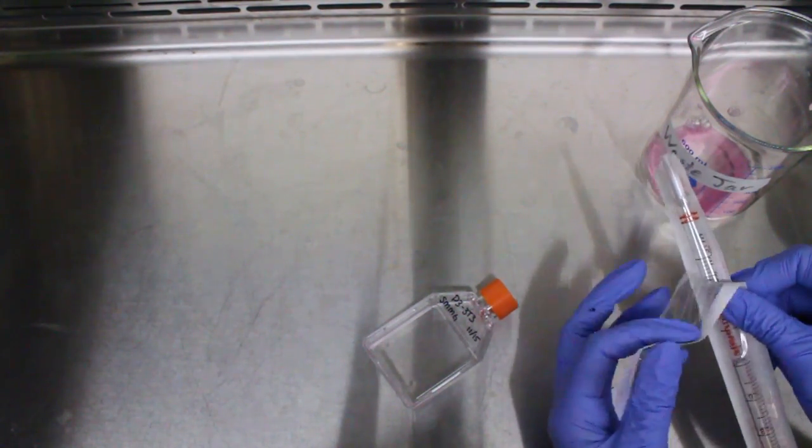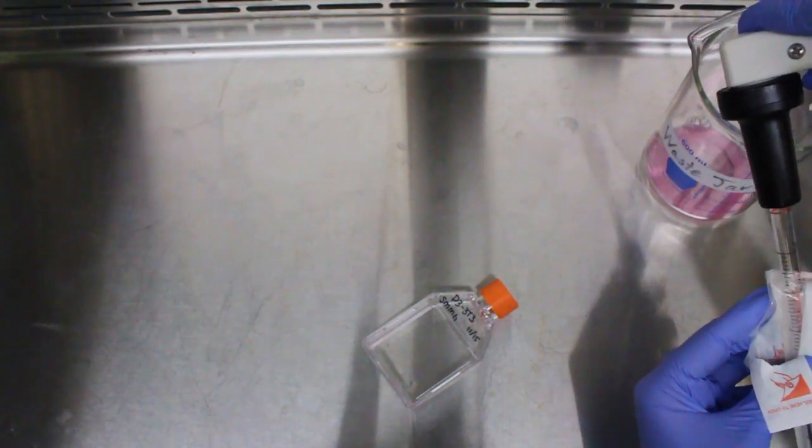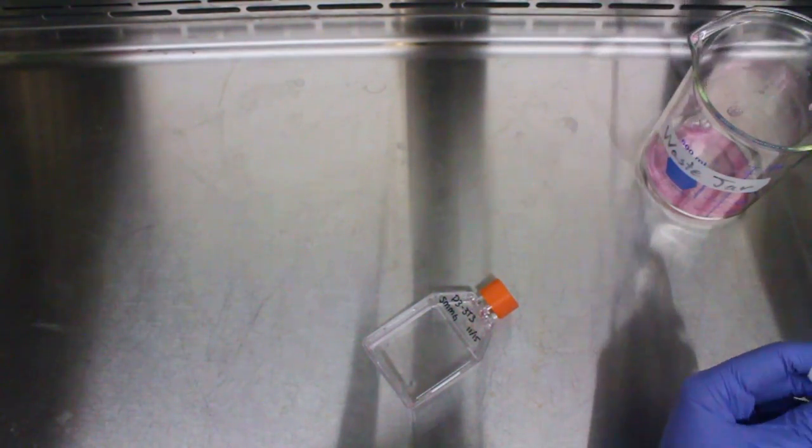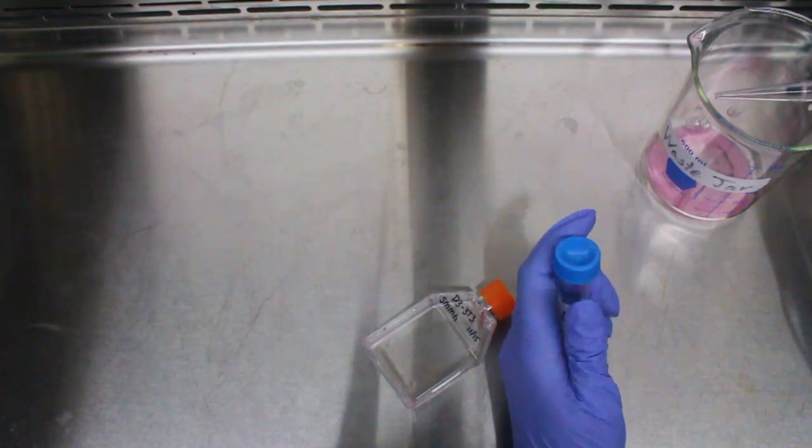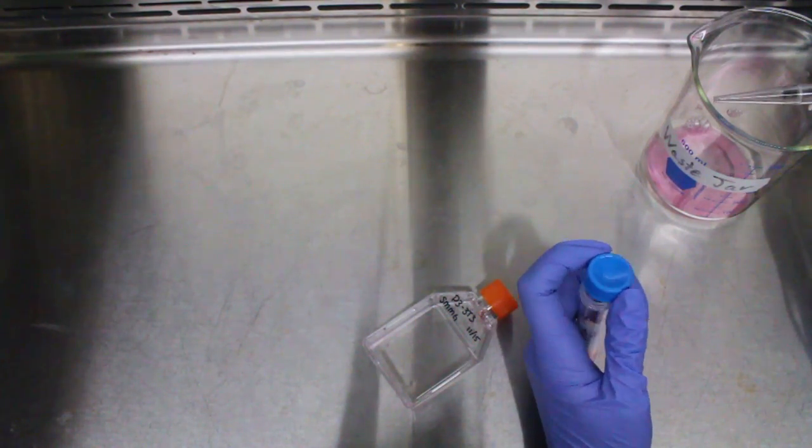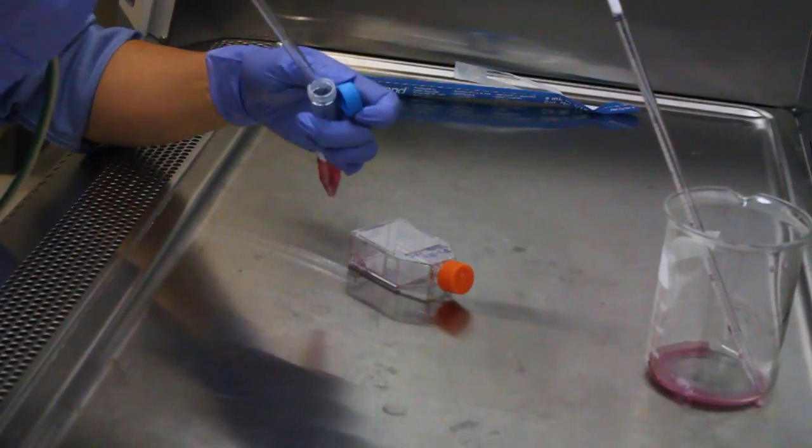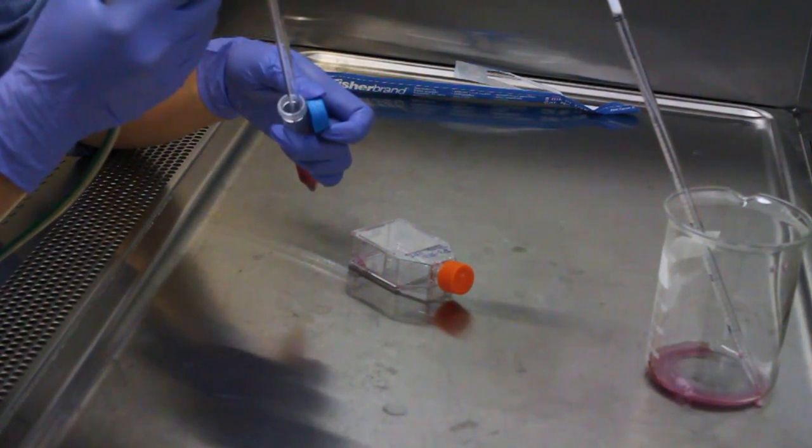Grab a new serological pipette and remember to always use sterile technique when opening your pipettes. We will be using trypsin to detach the cells today. Draw 2ml of trypsin and dispense it into the flask of cells.